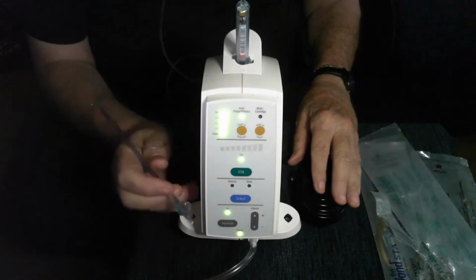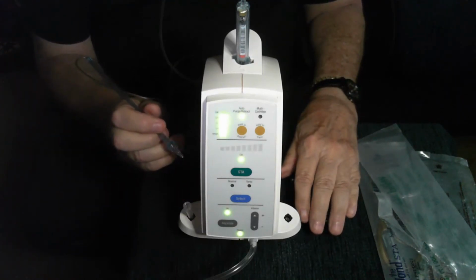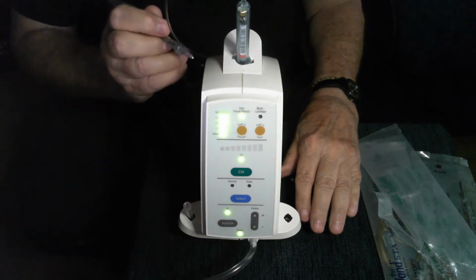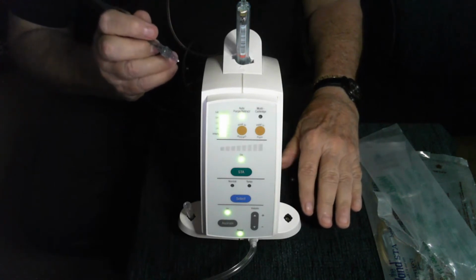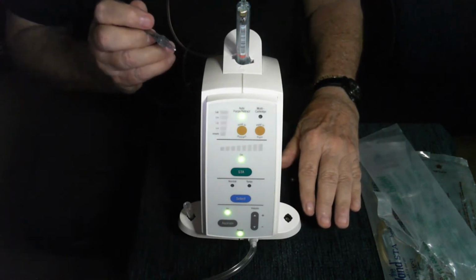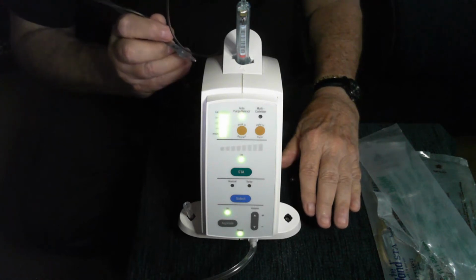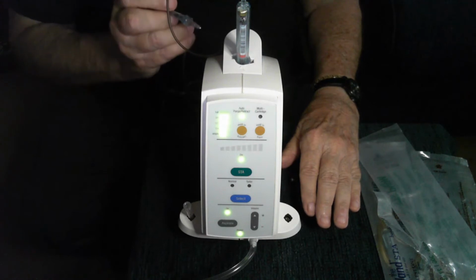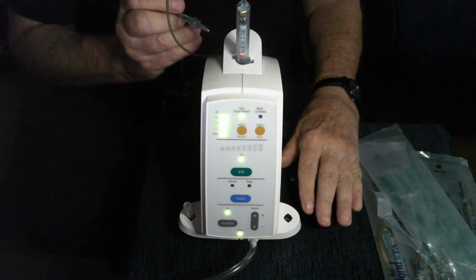So if I depress the foot pedal down, we're going to deliver the anesthetic at this control flow rate of 1 drop every 2 seconds. And like I said, this flow rate is below the patient's pain threshold. This needle could be in the sulcus, it could be in the palate of the patient, and they would not feel the delivery of the anesthetic.